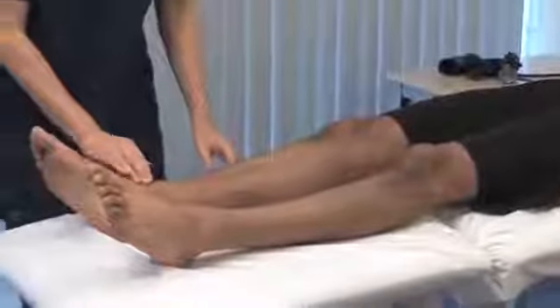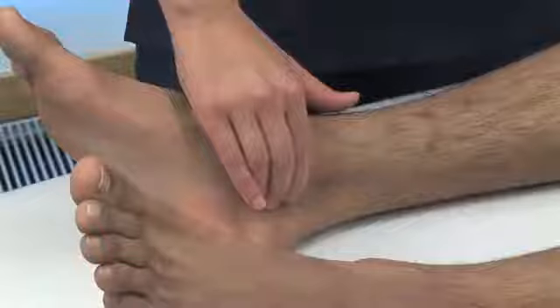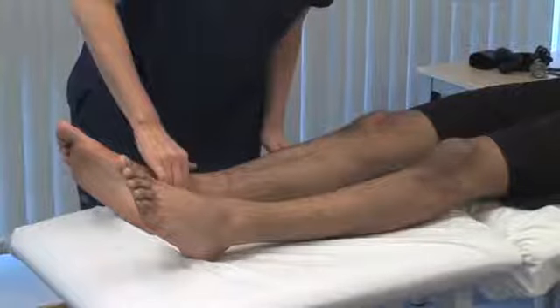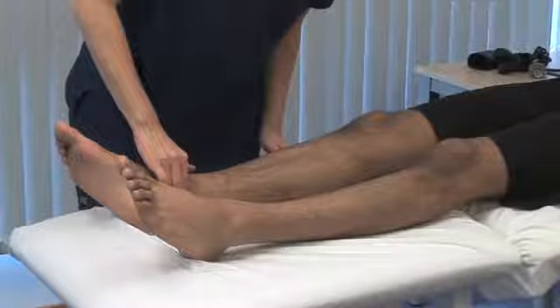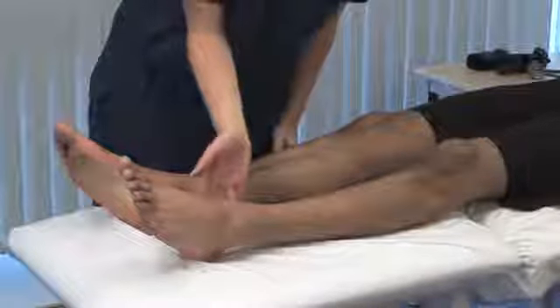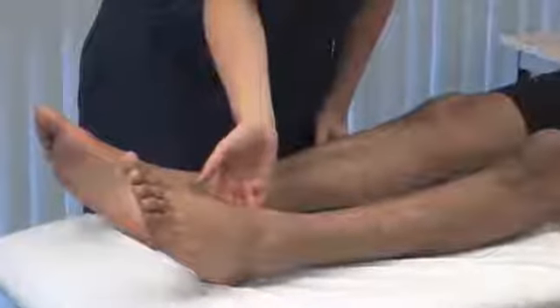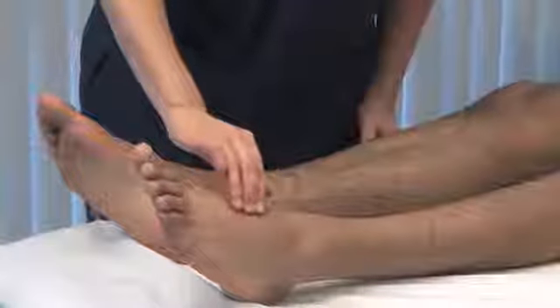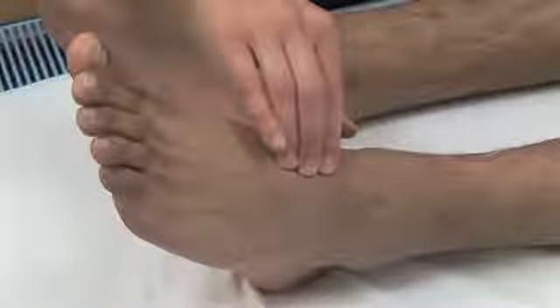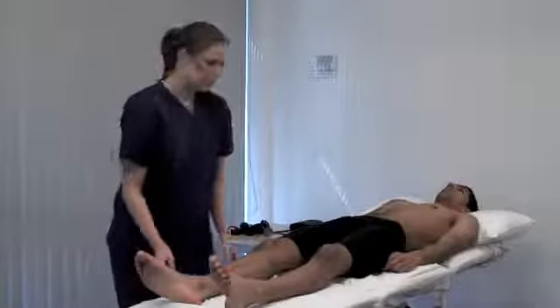Feel the posterior tibial pulse 2 centimeters behind and 2 centimeters below the medial malleolus of the ankle. Palpate using the pads of your middle 3 fingers. Feel midway down the dorsum of the foot, just lateral to the tendon of extensor hallucis longus, for the dorsalis pedis pulse. Use a Doppler probe to measure the ankle brachial pressure index.